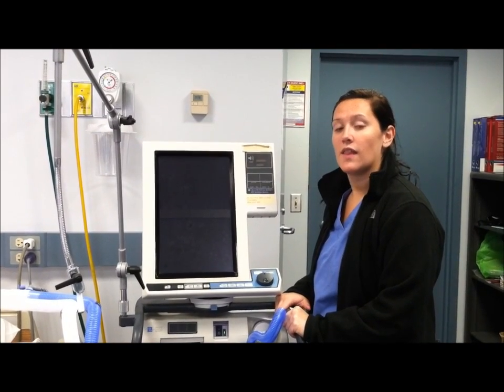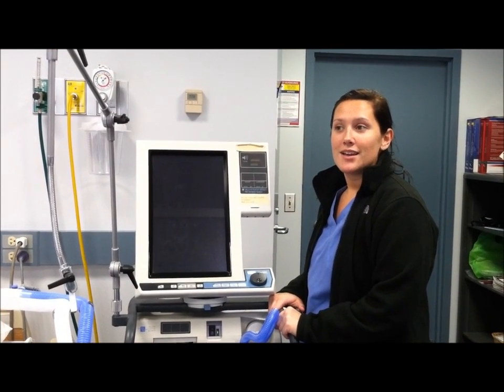Now we are going to set up a Servo i and an 840. When you set up your ventilator, it depends on the patient's disease process and the ABGs. We are just going to set up basic parameters, and what you set with pressure control is an I time, a frequency, a pressure above PEEP, and an FiO2.